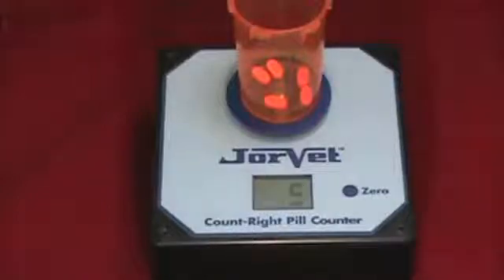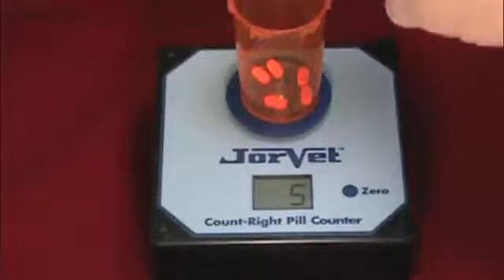The display will show a blinking five as the counter determines the weight of the five pills you have added. When the blinking stops, the counter has established the initial reference weight it will use to determine the pill count.